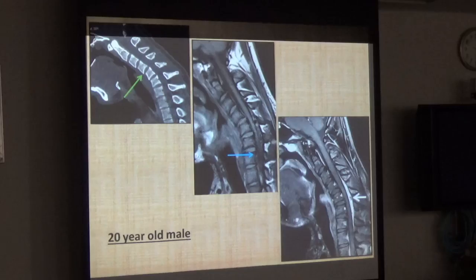On investigation, the CT scan reveals hyperflexibility of the cervical spine with a kyphotic deformity. The MRI is very interesting in these patients because the characteristics are a hallmark of the disease, which have been classified and documented in literature. If you can see, on flexion of the neck, there is a pseudomass on the lower subaxial cervical spine, which is contrast enhancing.